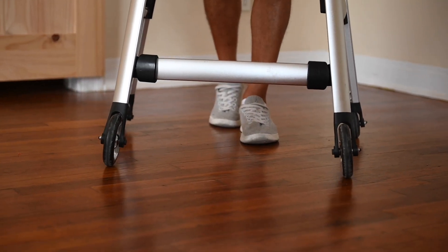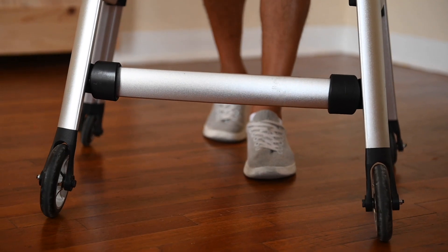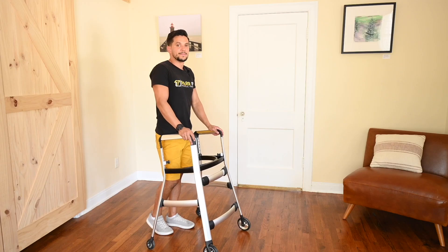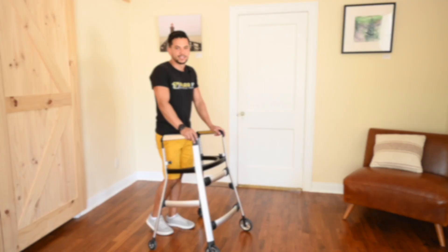Unlike other walkers that allow for steering in different directions, the Matrix ensures that the direction of walking is straightforward, providing more stability and reducing fall risk. These features are the reasons why the Matrix Gait Trainer is a great alternative to other walkers on the market, providing a safer and more stable walking experience.